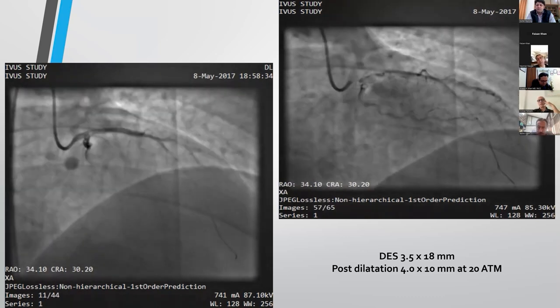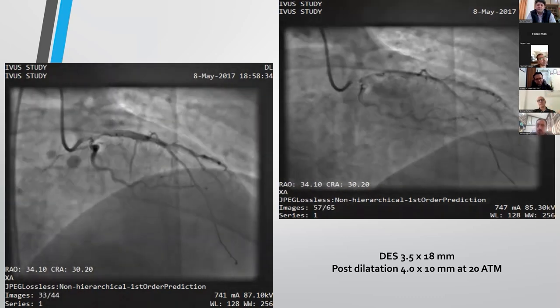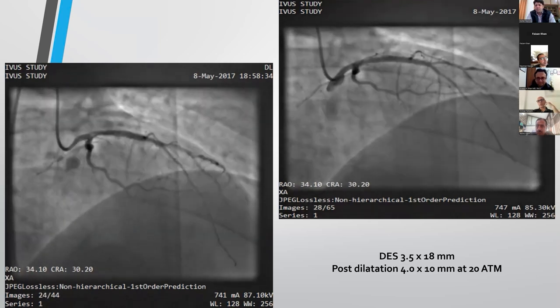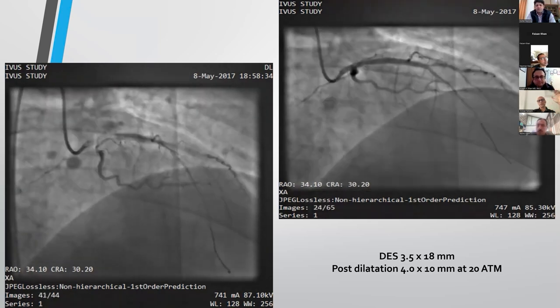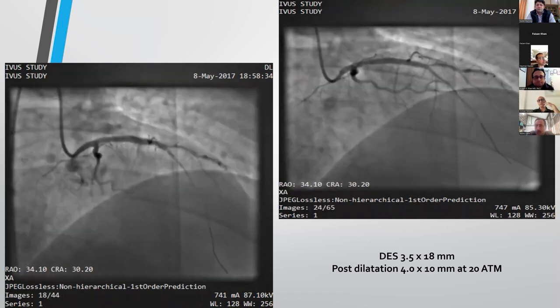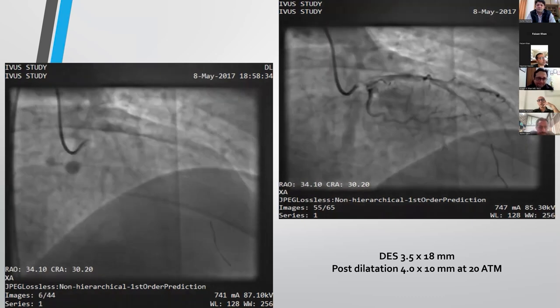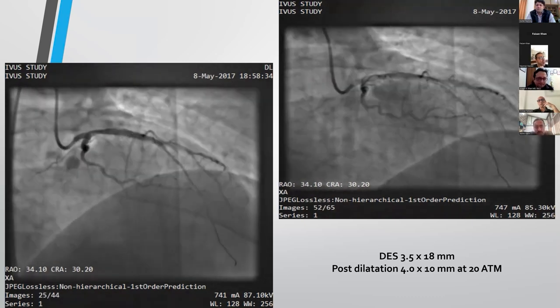So just thoughts from the group. One, do you always stent undersized stents again, or just balloon them and reevaluate? And second, a stent that's so undersized, 2.5 in a 4.0 vessel, that would obviously get fractured if you take it to 4.0, would be my question. How does that affect long-term issues?